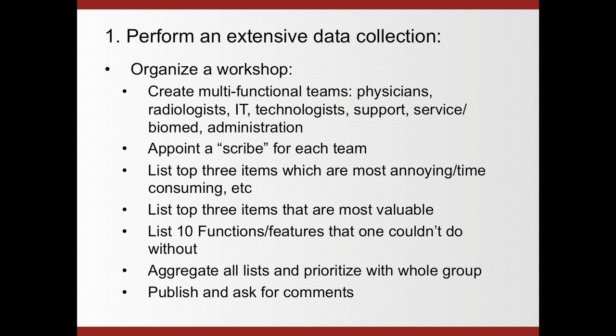So not only the people that are on the user end, such as physicians and radiologists and specialists, but also the support people such as the IT. And then, of course, the people that use the system on a daily basis, the technologists, and also service and biomedical people, and the administration. And you find out that each group or each profession has a completely different viewpoint.